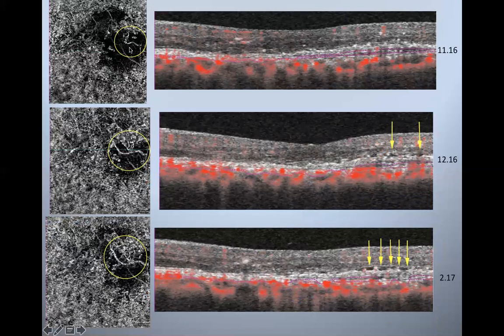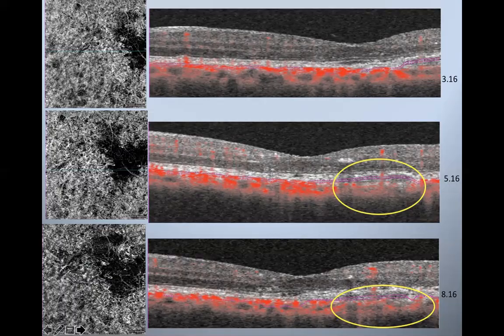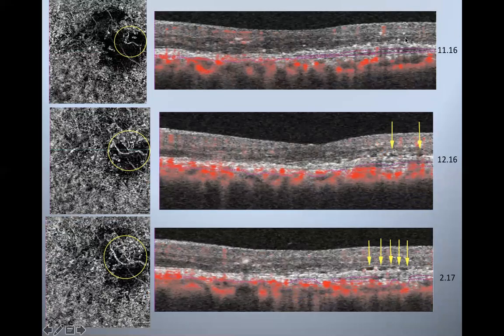Now, when we see this patient a couple months later, we first saw this patient in March, and now we go all the way to November, the OCT B-scan pattern looks the same, there's nothing really happening here, but look at the OCT-A on the left. Now it's a very large dark area, and there's a very odd looking blood vessel that's kind of coursing through here, and some other blood vessels that are still kind of crawling across here. Finally, in December of that year, we started seeing a little bit of fluid going on down here, possibly. If you don't look close, you probably might have missed it. Look at the OCT-A.